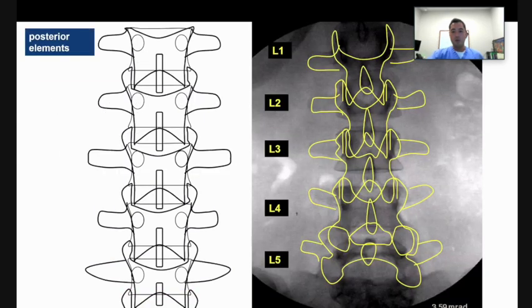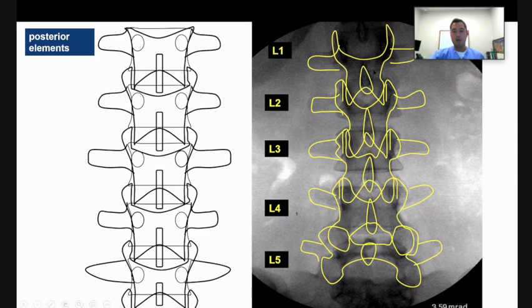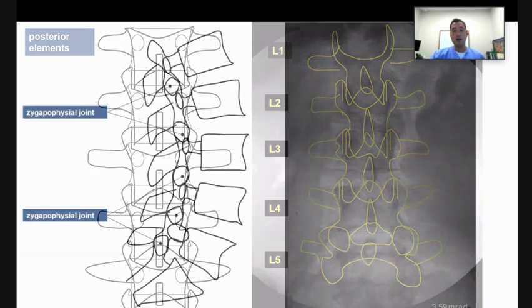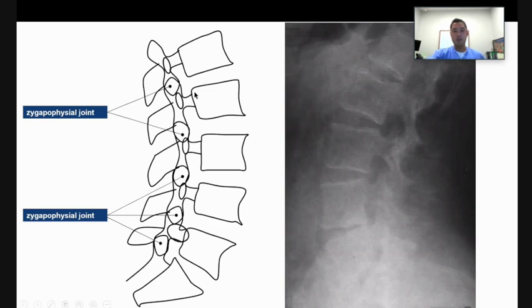Here's a prime example. When you're in the fluoroscopy suite looking at someone in the AP — or PA — view, you can look at different elements. There's a drawing on the left and the outline under fluoroscopy. In the center, you have the spinous process, which looks like a teardrop. On the sides you have the transverse process, the facet joints, and the vertebral body. When you're looking at a lateral view, you can see the facet joint — also known as the zygapophysial joint — the neural foramen where the nerve exits, and the vertebral body. Getting familiar with what you're looking at is reinforced by drawing it out.